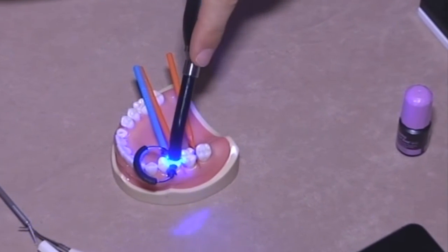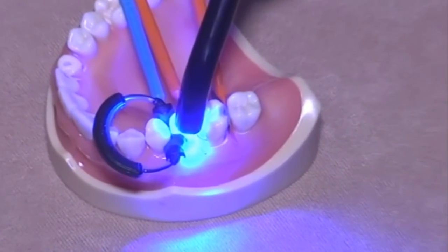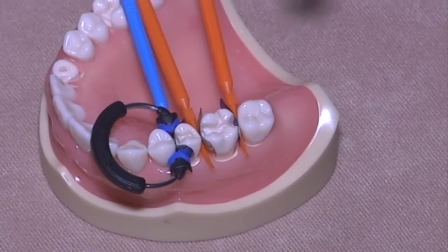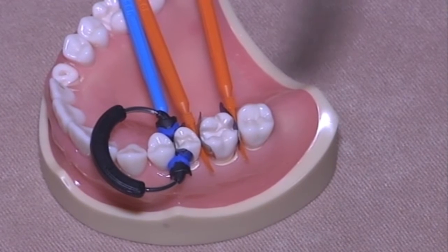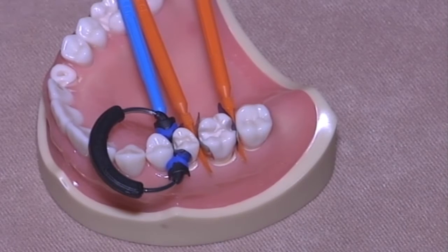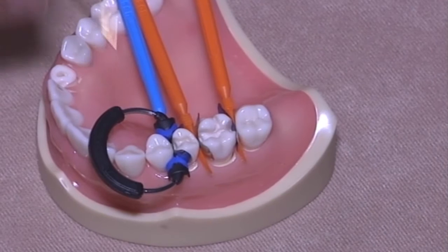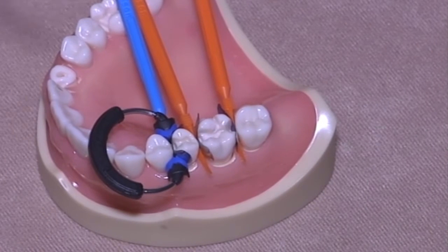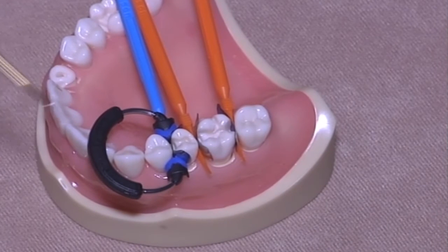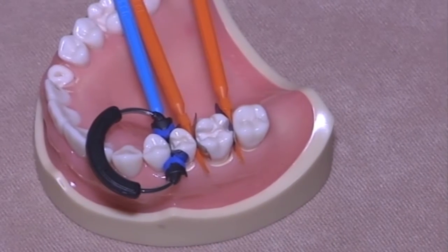light cure. And remember that because of the distance between the curing tip and the bottom of the cavity, the step that needs the higher curing time is the adhesive curing, because it's the part of your restoration which is most far away from the tip. So it's better to cure the adhesive 10 seconds more than the composite, which is going to arrive in a while.